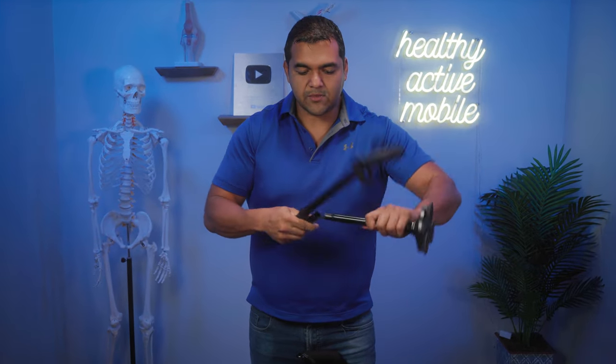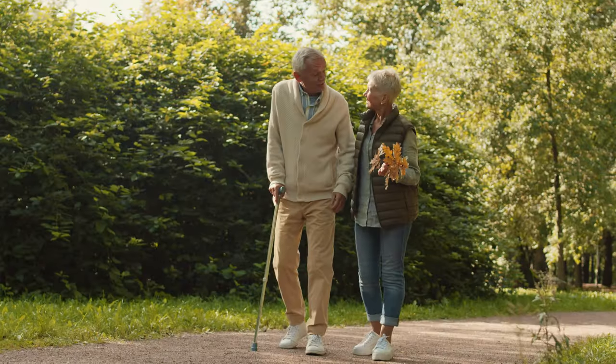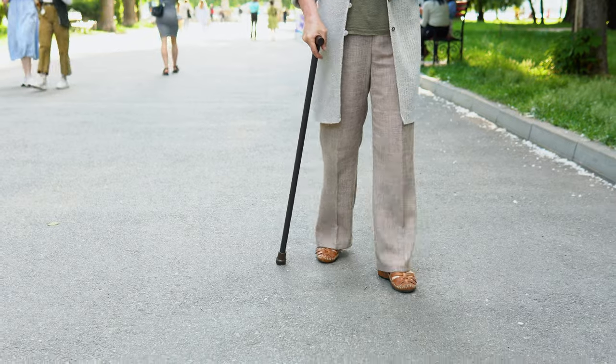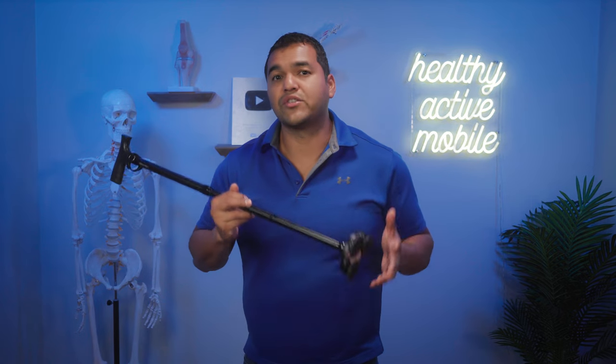Another feature of certain canes is that they can break down and fold away for situations where you need to keep it compact. Always consider what kind of terrain you'll be on. If you're going somewhere unfamiliar and might encounter stairs or uneven, sloped ground, you might want something with a bigger base to ensure you maintain your balance the whole time.